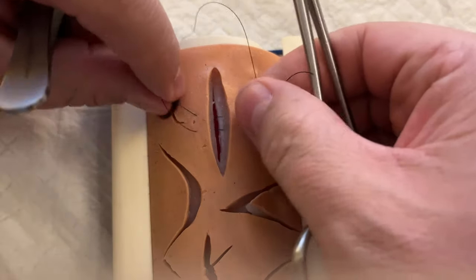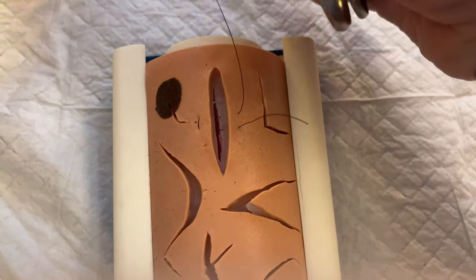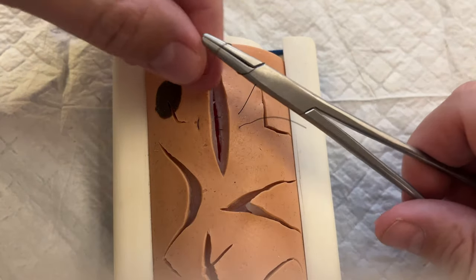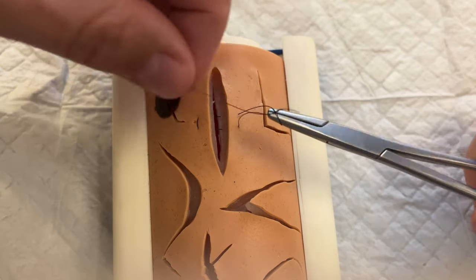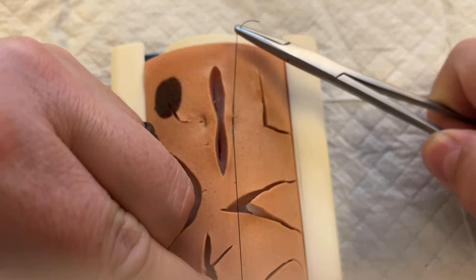We pull this tight and complete a simple instrument tie on the side in the usual fashion — a surgeon's knot first, going around the needle driver twice, grabbing that suture and pulling it down. With this you can pull a decent amount of pressure.